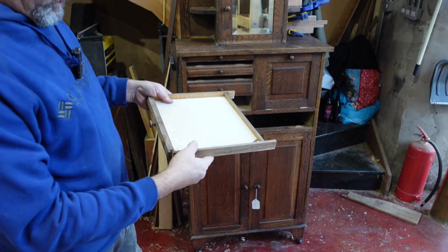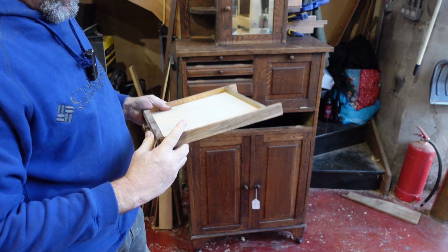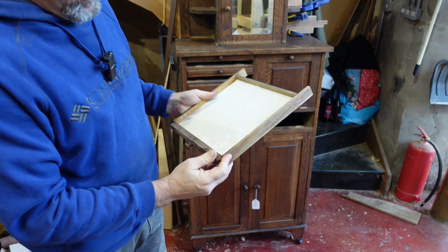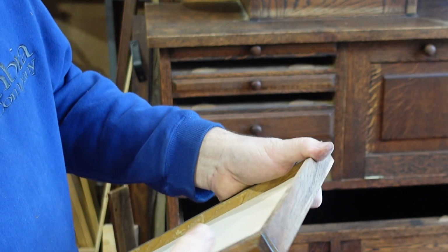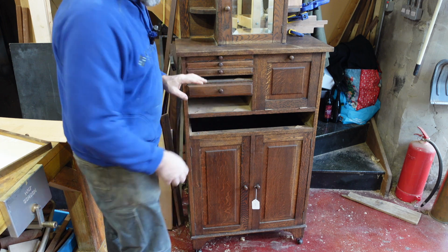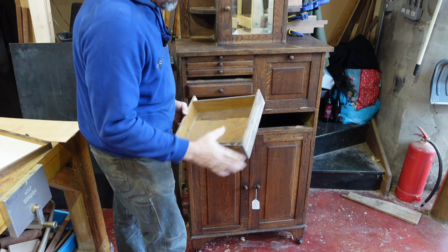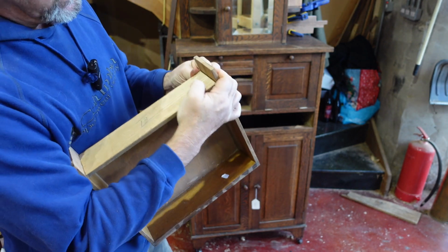So now I've got to try and fit some of these, but they'll need to be repaired first because that's coming apart. So I need to figure out what needs glued, where it all goes. I think what we'll do is glue these first and then fit them to shape, because you can see that they've burst and split. They're a bit stiff, so could just put some candle wax on, but they may need a little bit of planing. Now that doesn't fit at all. Also split apart, so that's going to need brought back together.